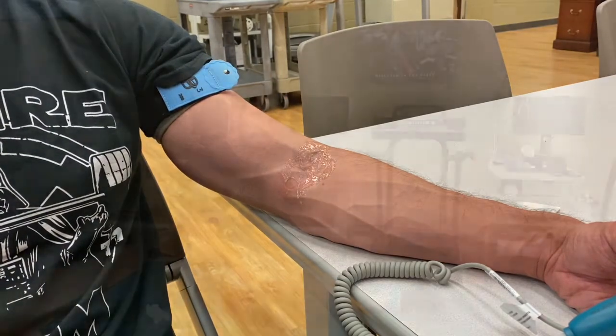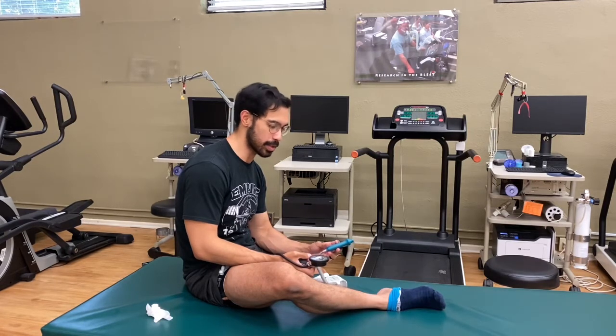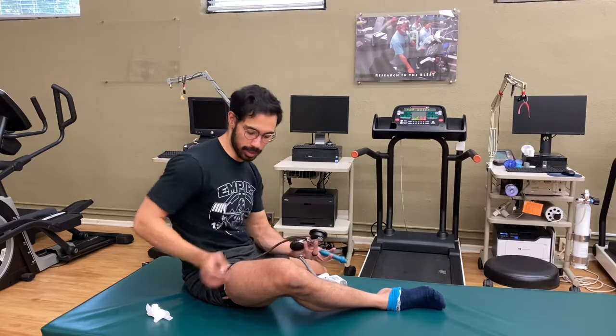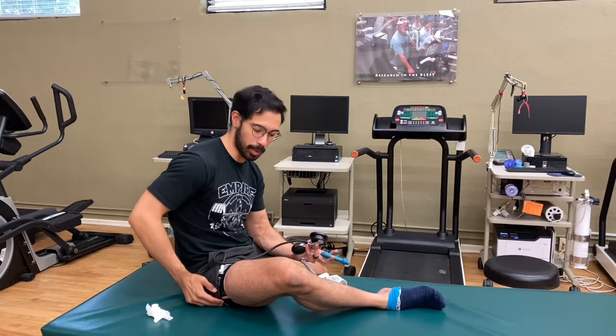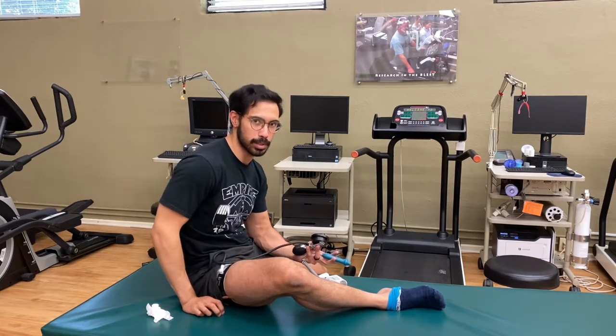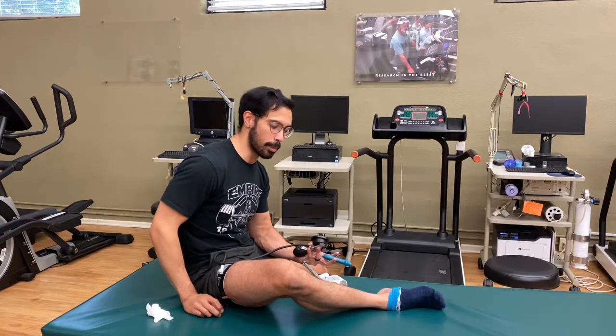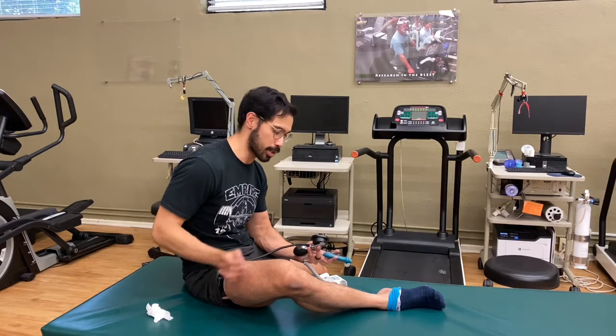All right, so in order to determine AOP utilizing ultrasound Doppler, first what you're going to need to do is take your cuff. You're going to need to tighten your cuff as proximal to the torso as possible. So we want to go as high to the hip as possible because we're trying to get as much of the leg musculature involved as possible when we're talking about cutting off blood flow. Obviously, we're not going to be exercising with cut off blood flow. We're going to be pulling back like I had mentioned before.